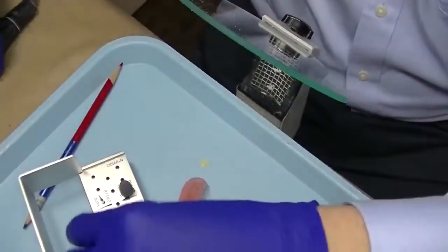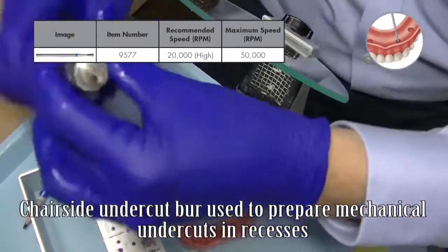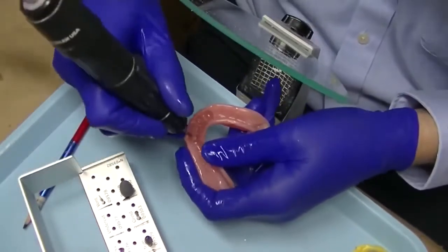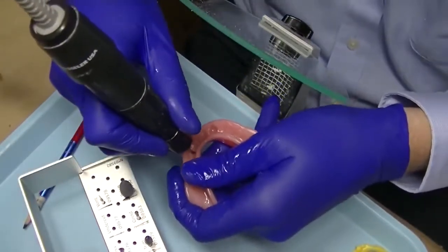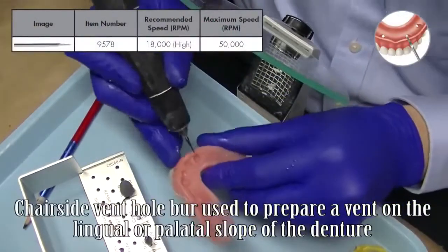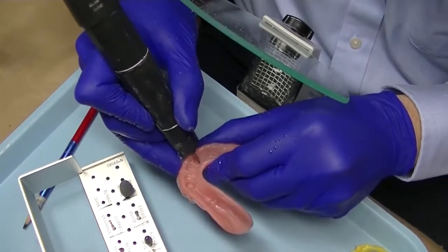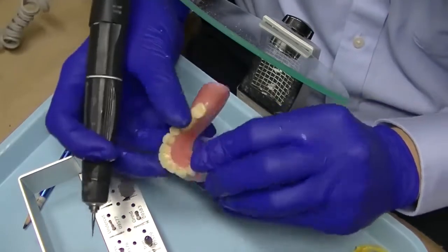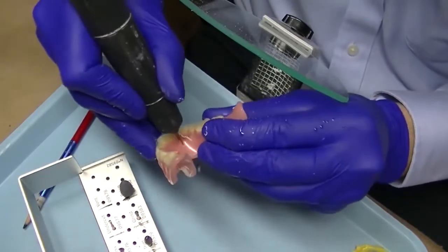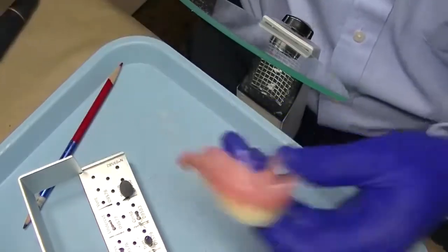The denture is taken back to the laboratory where the chairside undercut burr is used around the recess preparations to prepare mechanical undercuts. Mechanical undercuts are going to aid in retention of the chairside attachment processing material when doing the attachment pickup. The vent hole burr is also utilized to create a lingual or palatal vent for the attachment processing material to easily vent or flow out through the holes of the lingual or palatal surface of the complete denture. This will minimize any chance of pressure of the denture on the ridge.